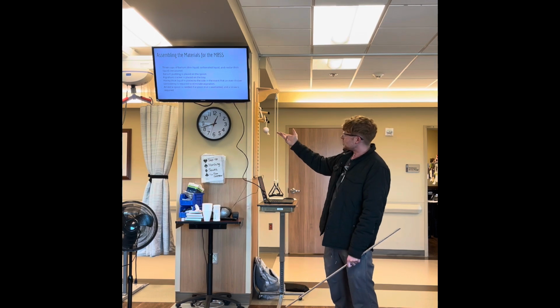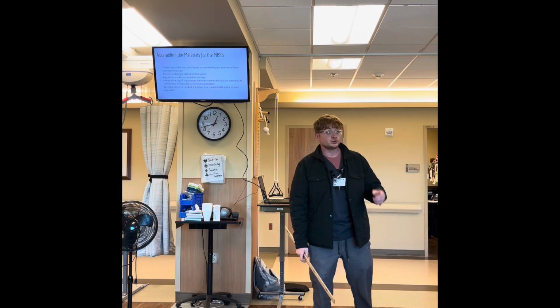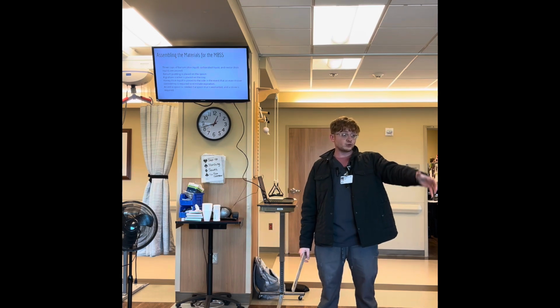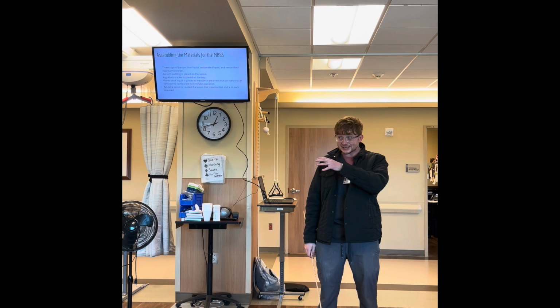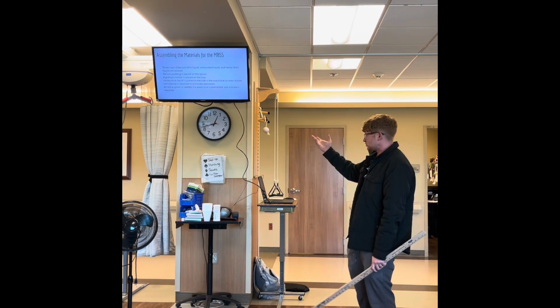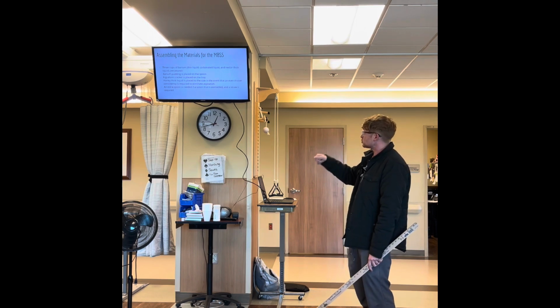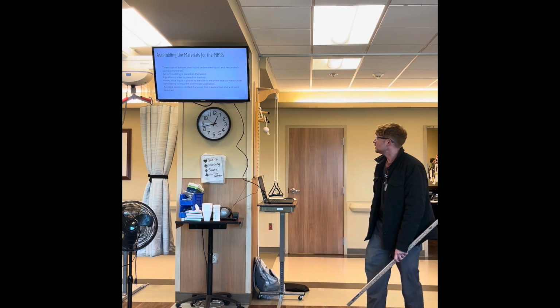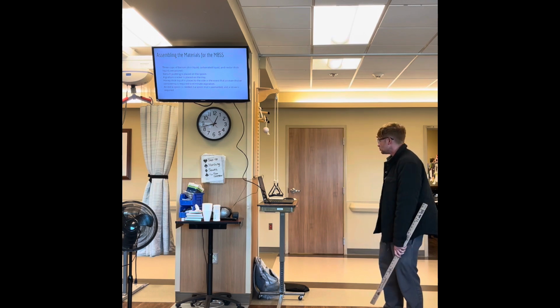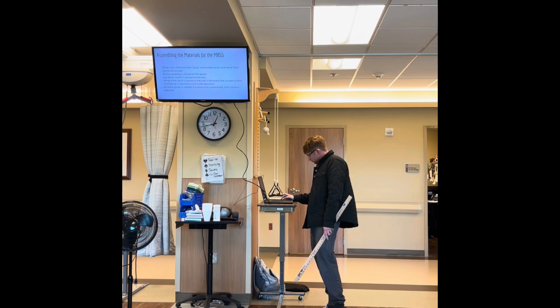And then sometimes you might need an extra spoon, especially if you get someone off the floor who you don't want to give a cup and say, here, go for it. If you really think from bedside there's some aspiration, you don't want them to tip a cup back and you just visualize a lot of aspiration. That won't help anything. So you can do a spoonful trial. That way you can keep it down. And obviously a straw, because we do trials from the straw during the liquids too.